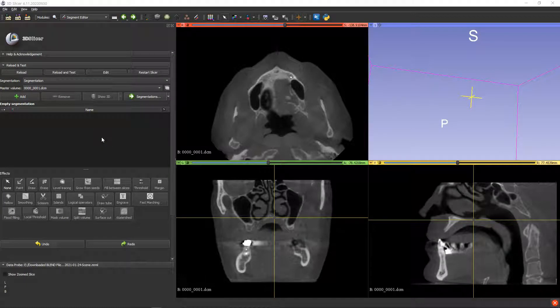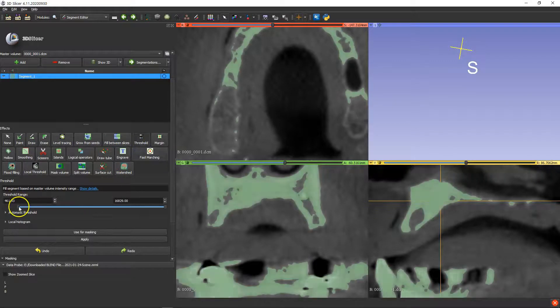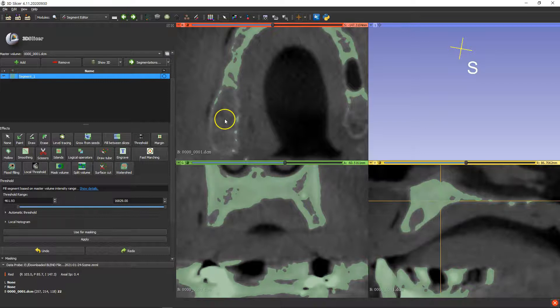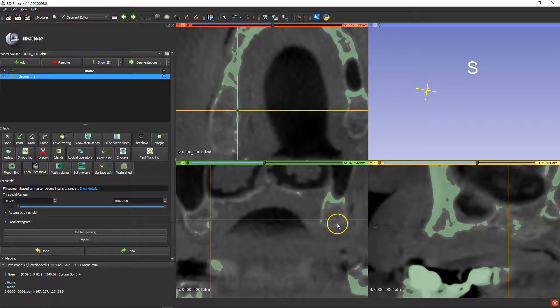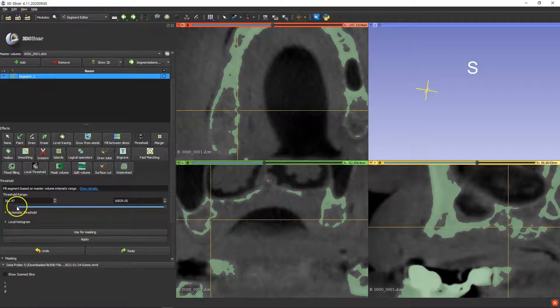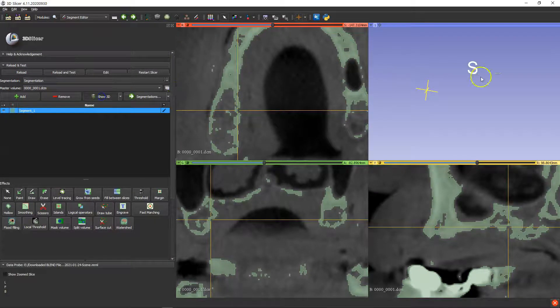Now that we're doing some implant planning, we need a sectional model that we can use to align the model to the DICOM. So here we go — we add a slice, threshold, and perhaps we set the threshold a little bit more. We can barely see the bone over here, so let's add a little bit more like that, and perhaps even a little bit more, and apply, and then show in 3D.